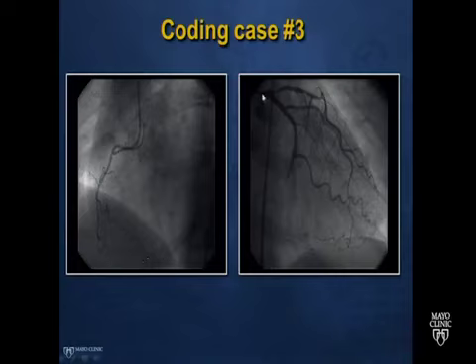Here, this is a picture of the left coronary artery. This is a right anterior oblique view because the ribs are going down on the right side of the screen. There's a lesion here in the proximal segment of the LAD, which is severe. This is the anterior wall, LAD here. There's also complete occlusion of the circumflex, which one sees here. And then there are also these collateral branches here.